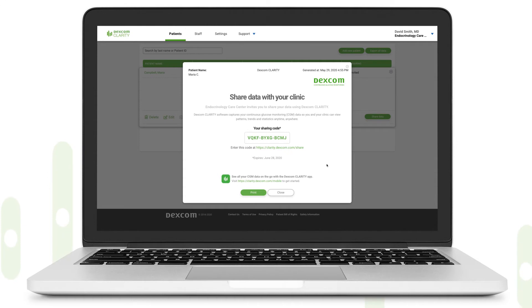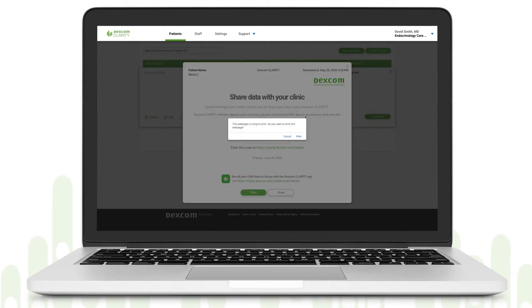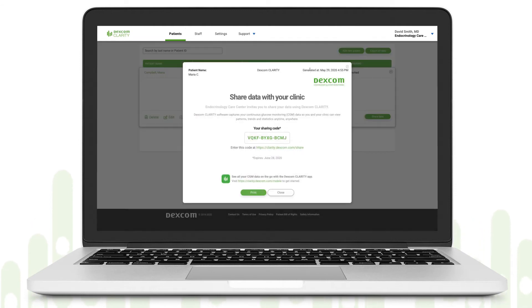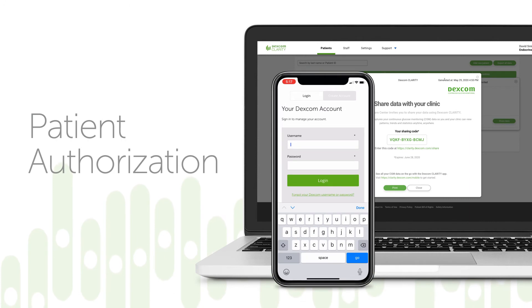You can help patients begin sharing by having them download the Dexcom Clarity app on their smartphone before or during their appointment. You can also print or email this sharing page so patients can authorize sharing in their own time.